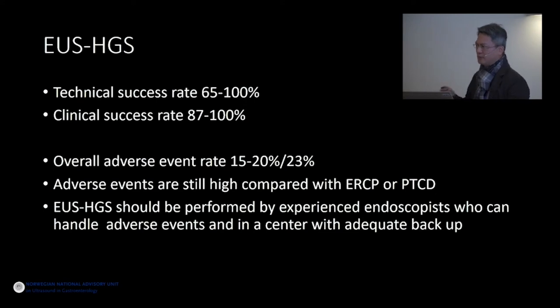It's very superior compared to all the other kinds of biliary drainage, but you have to be aware that it has an overall adverse event rate of more than 20%. And in the worst case, you have mortality. That's why this procedure should only be performed by a very skilled endoscopist with adequate backup.